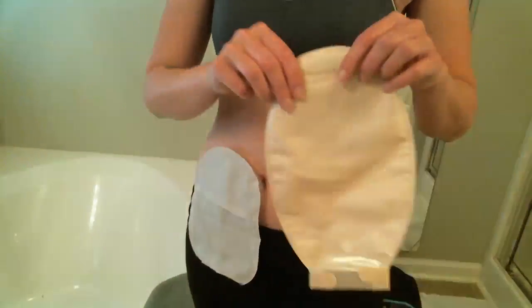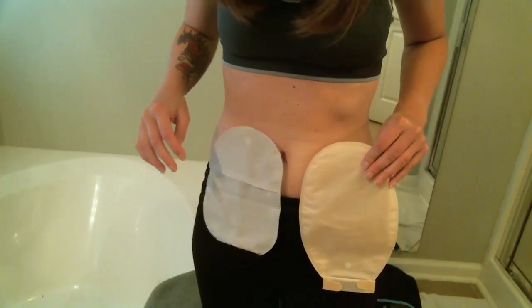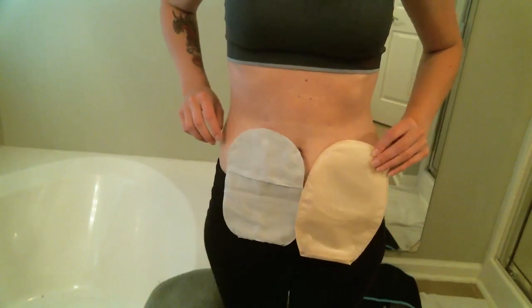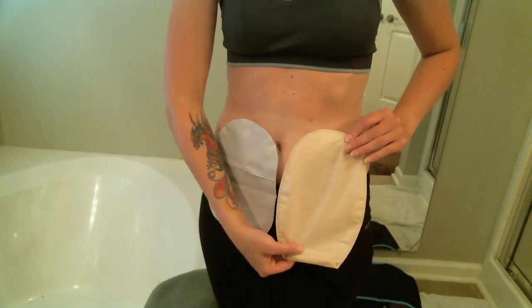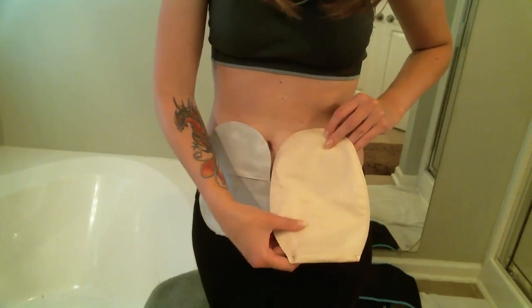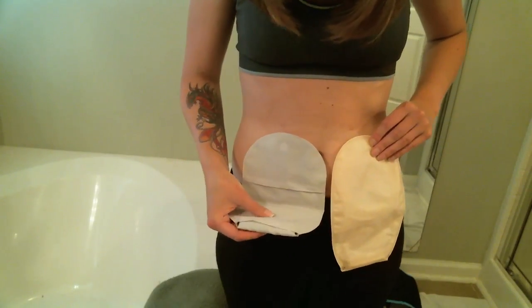So you can see it here. Here is another Coloplast one-piece, the previous type. So you can see it's about the same size here, maybe a little bit smaller, and it is a little more rectangular shape, while this has a bit more of an oval shape. Of course, you can tell that it is a completely different color rather than being a little more flesh tone. This one is more gray colored.